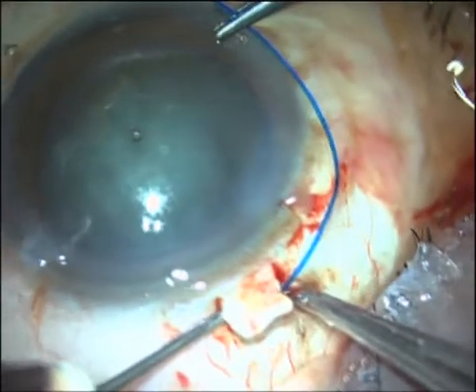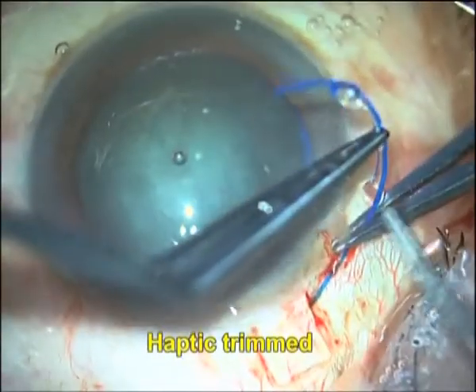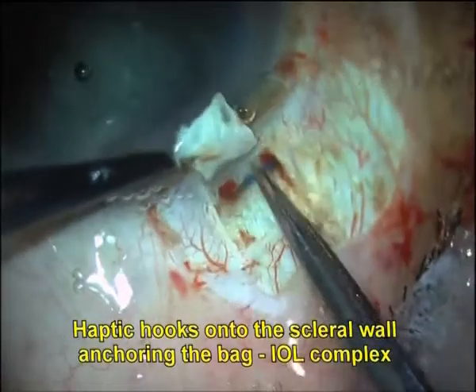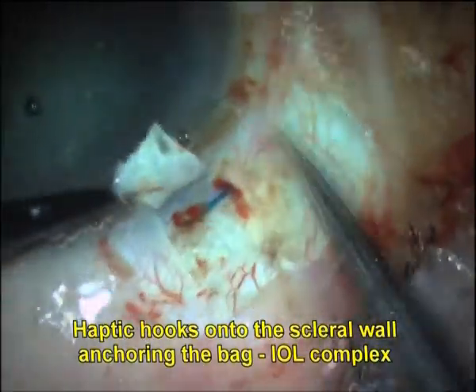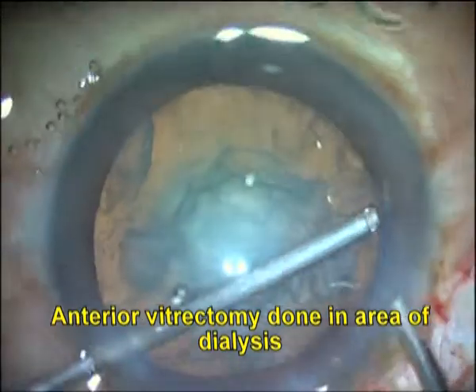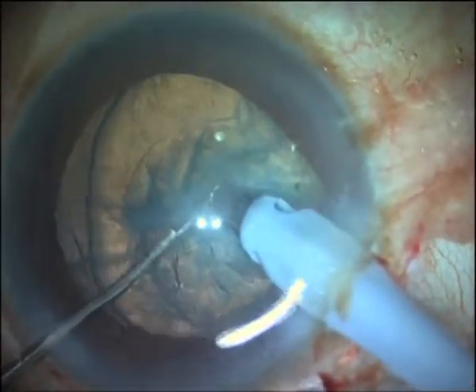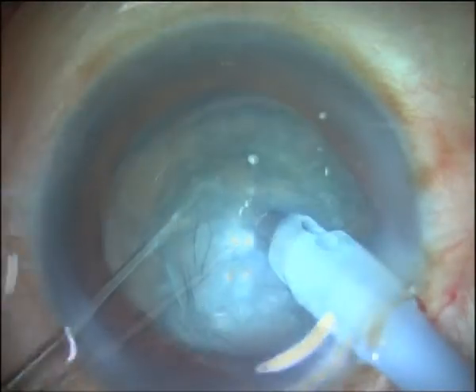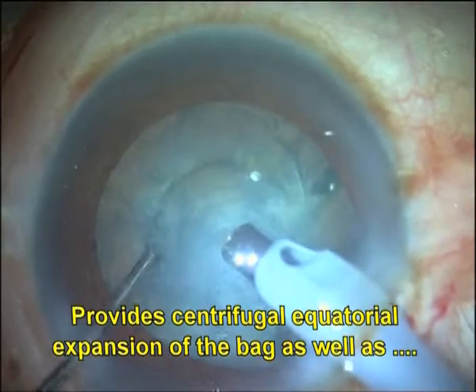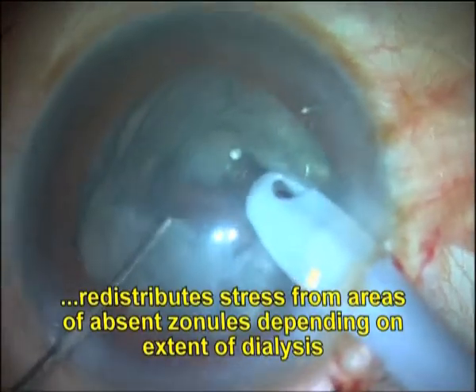A 26-gauge needle is used to make a scleral tunnel at the edge of the flap. The haptic is trimmed to the desired length and tucked into the scleral tunnel. Anterior vitrectomy is done in case of vitreous prolapse into the anterior chamber. Phaco emulsification is then carried on as usual, followed by epinucleus and cortex aspiration.